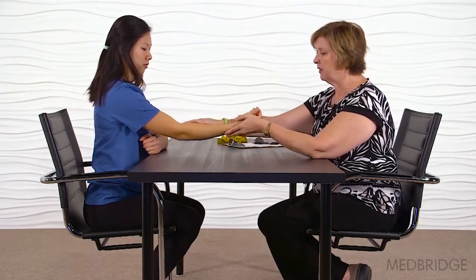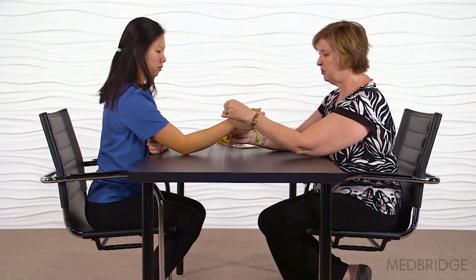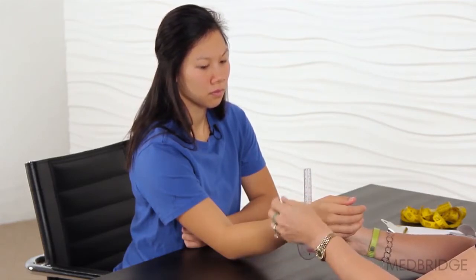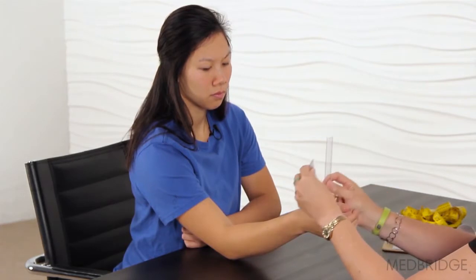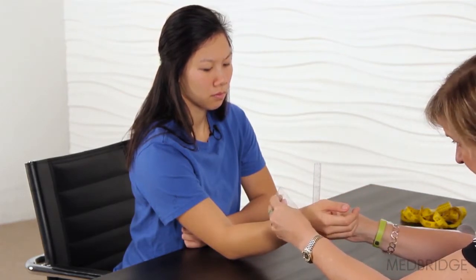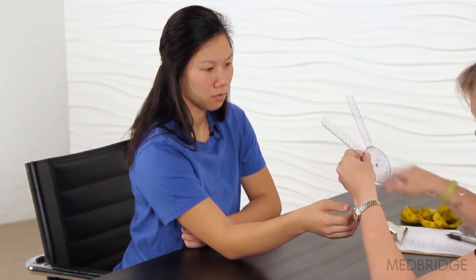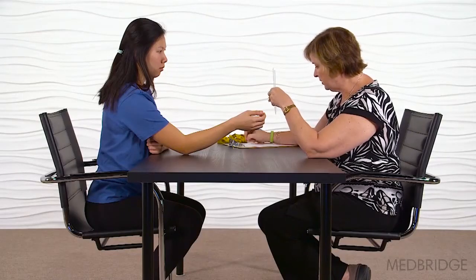Now let's see what's going on with the forearm. We'll start here because that's neutral, and I'm going to take my measuring device. Straight up in the air is neutral. Now what I'd like you to do is turn your palm up and try to get your hand over as far as you can. I've got it lined up here and I can see that's about 45 degrees of forearm supination.